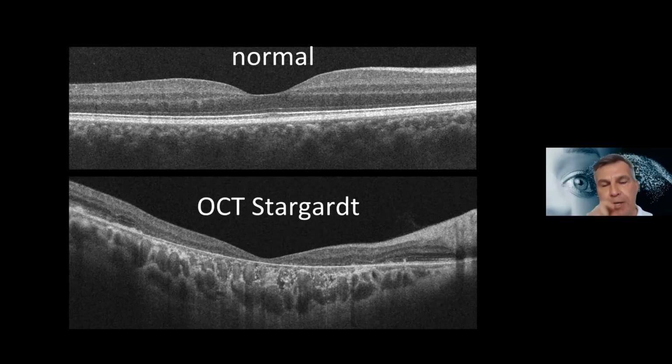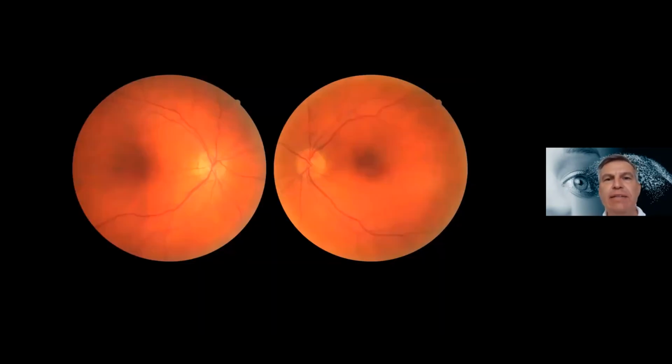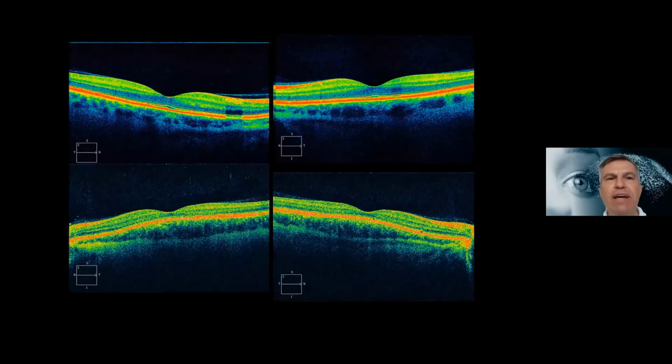So the cross-sectional imaging with OCT is giving you structural information, not cellular, but structure of every layer, also of the choroid. In this patient, you see a color fundus image of the optic disc and the macula in the center. It's not an ape, it's a human man, you see. The optic disc is orange, it's normal. And look here, the top level is his cross-sectional imaging with a nice fovea depression.